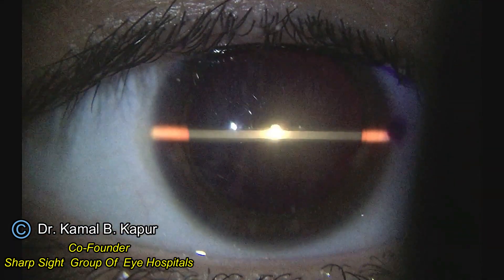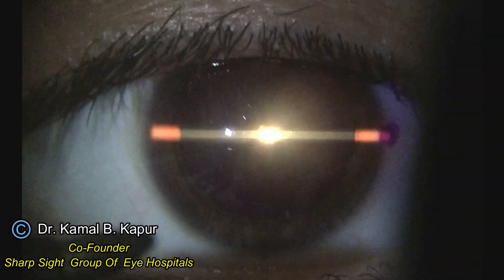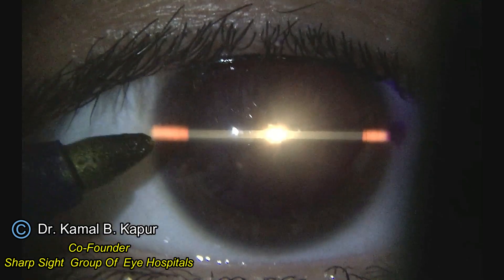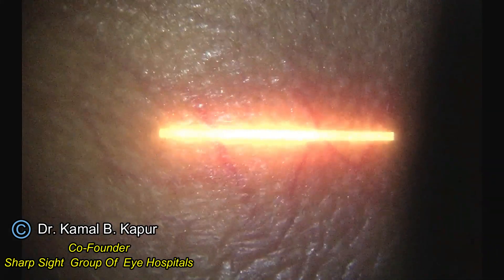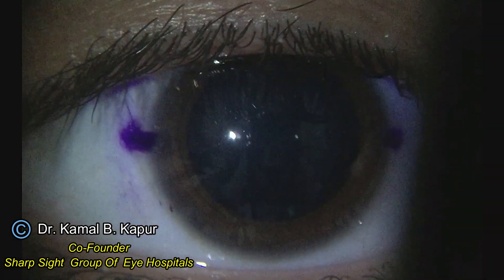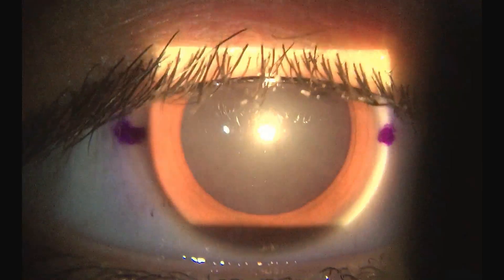We can also use this technique to identify if the IOL has been rotated or not, by making the patient look into the light and then rotating the slit beam to identify the axis of placement of the IOL, which can confirm whether the placement of the IOL in the toric axis is correct or not.